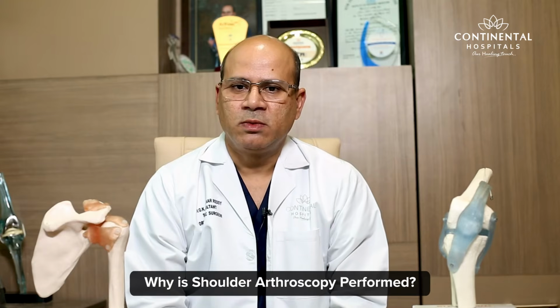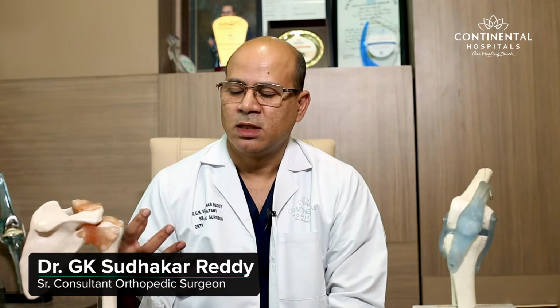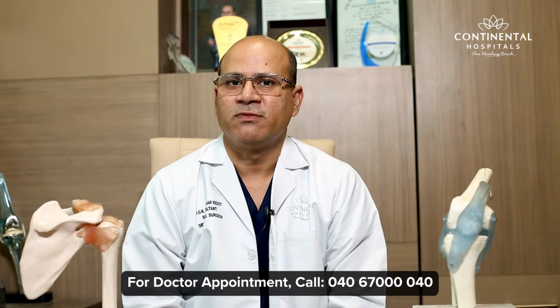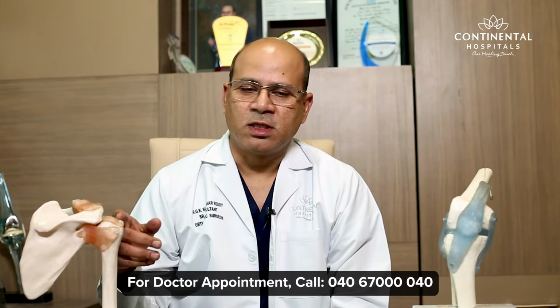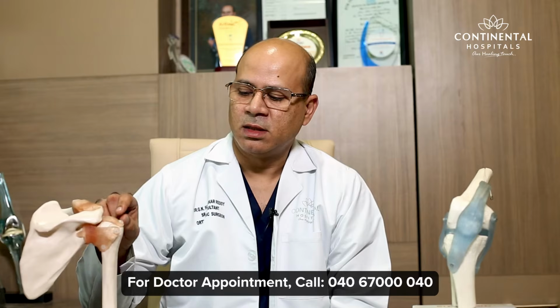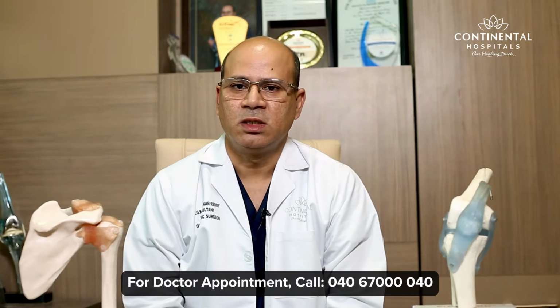In the shoulder as well, we can treat with arthroscopic techniques. Commonly diagnosed or treatable conditions are frozen shoulder, where the patients have pain and stiffness, and if they're not responding to painkillers and physiotherapy, we pass the camera into the joint and release the adhesions. Other conditions are rotator cuff tears, where there's weakness and pain on lifting. We can repair the tendons and suture them back to the bone to improve the function in the shoulder.